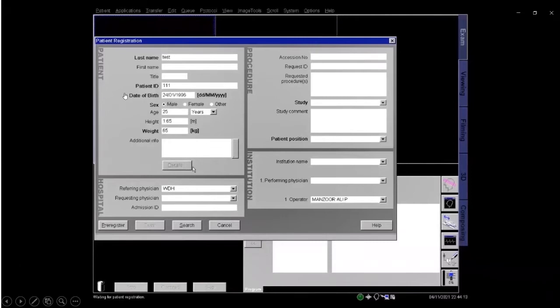We can see all the bolded areas. All the bold written areas are needed to start the scan. Until we are done with that, we won't get the exam option.